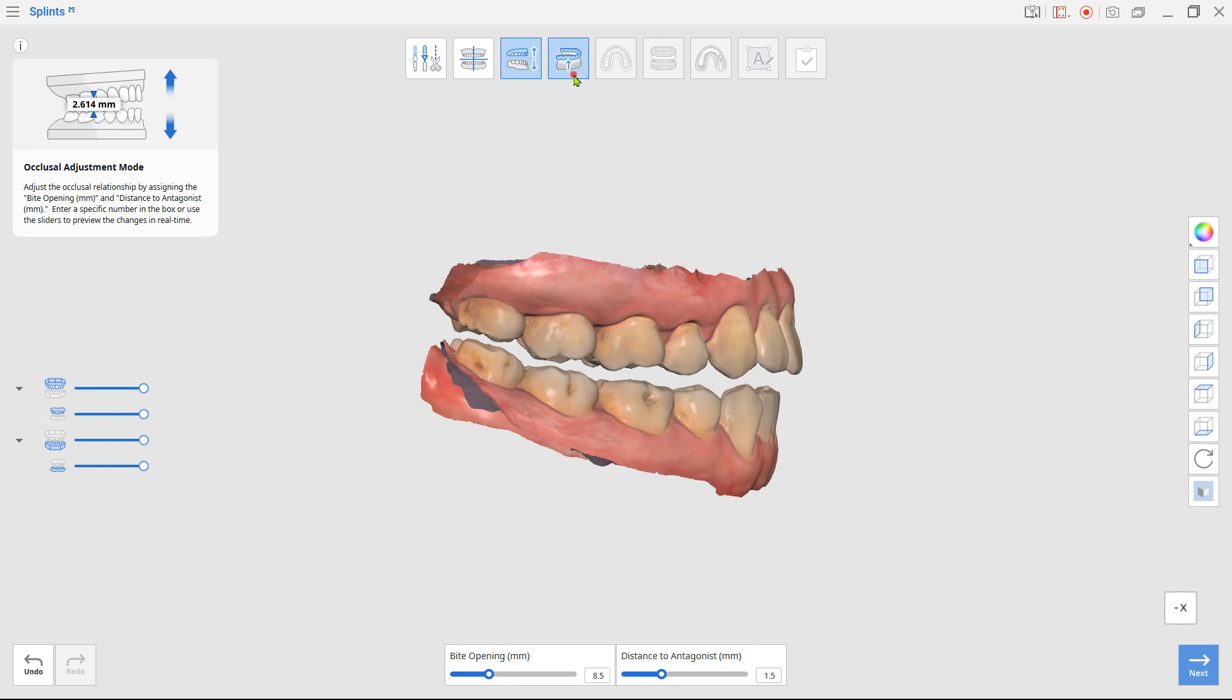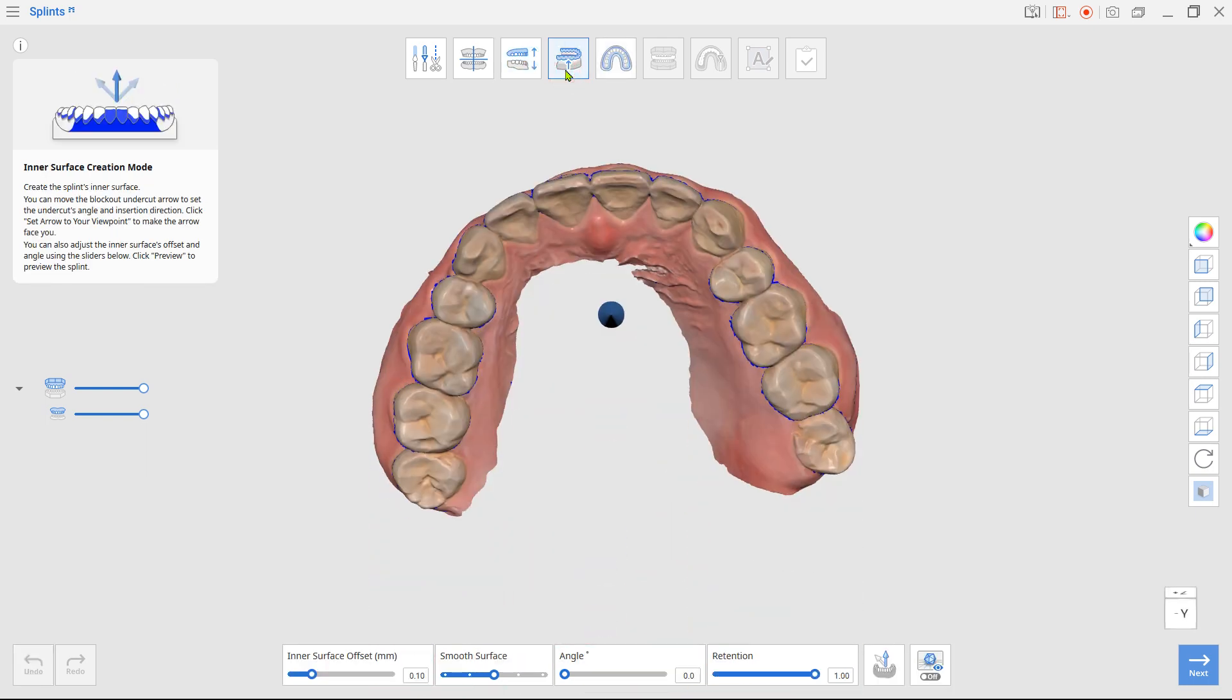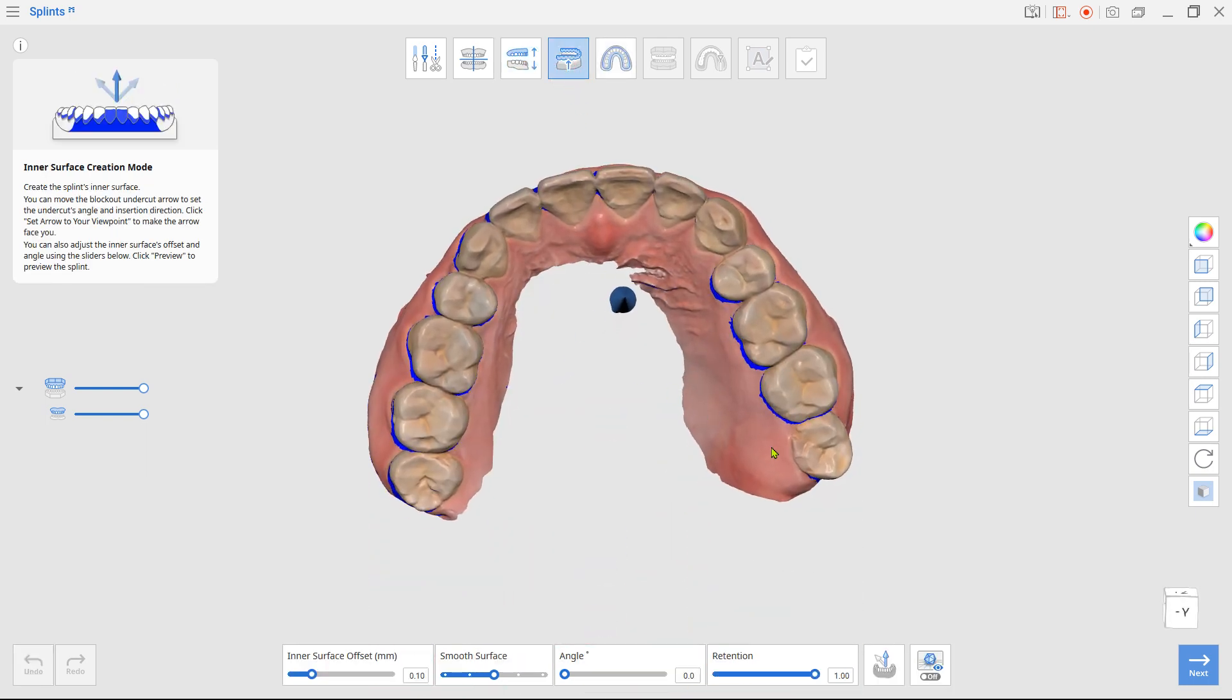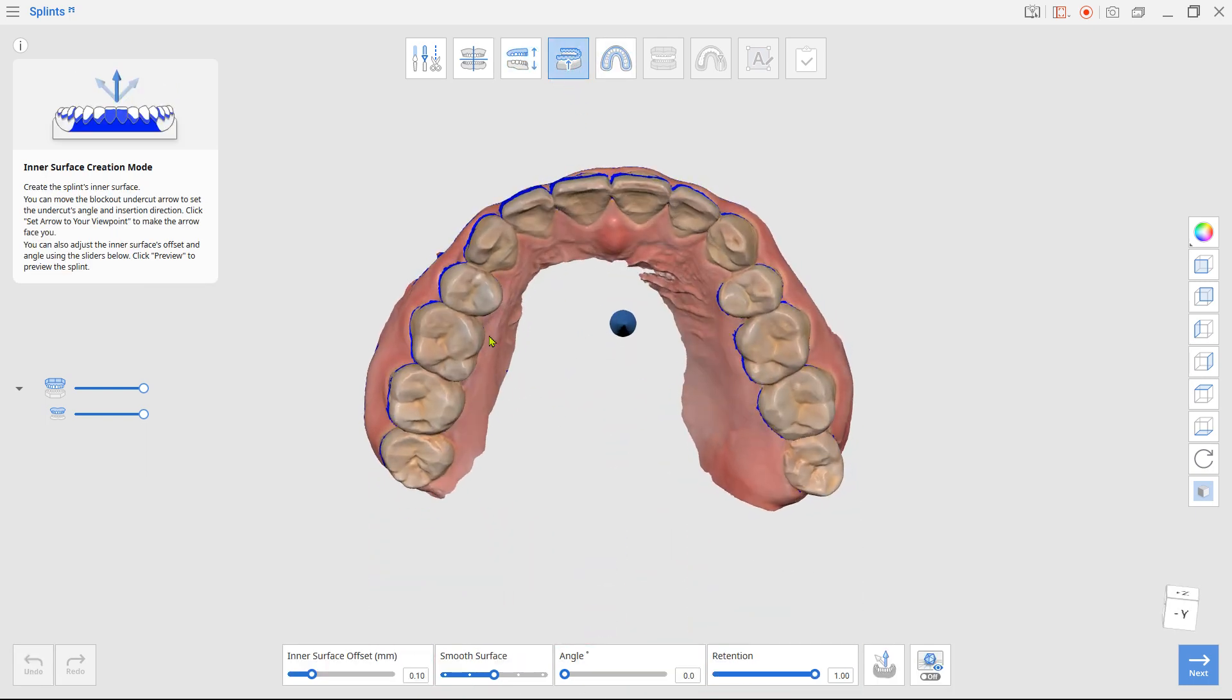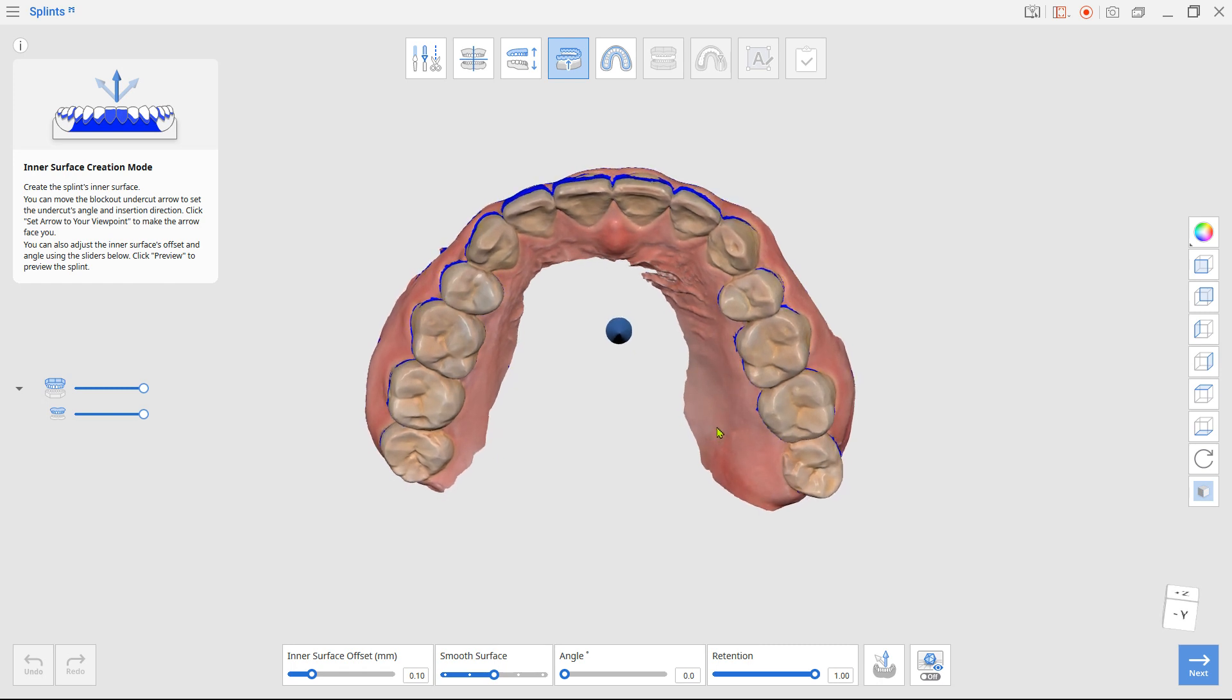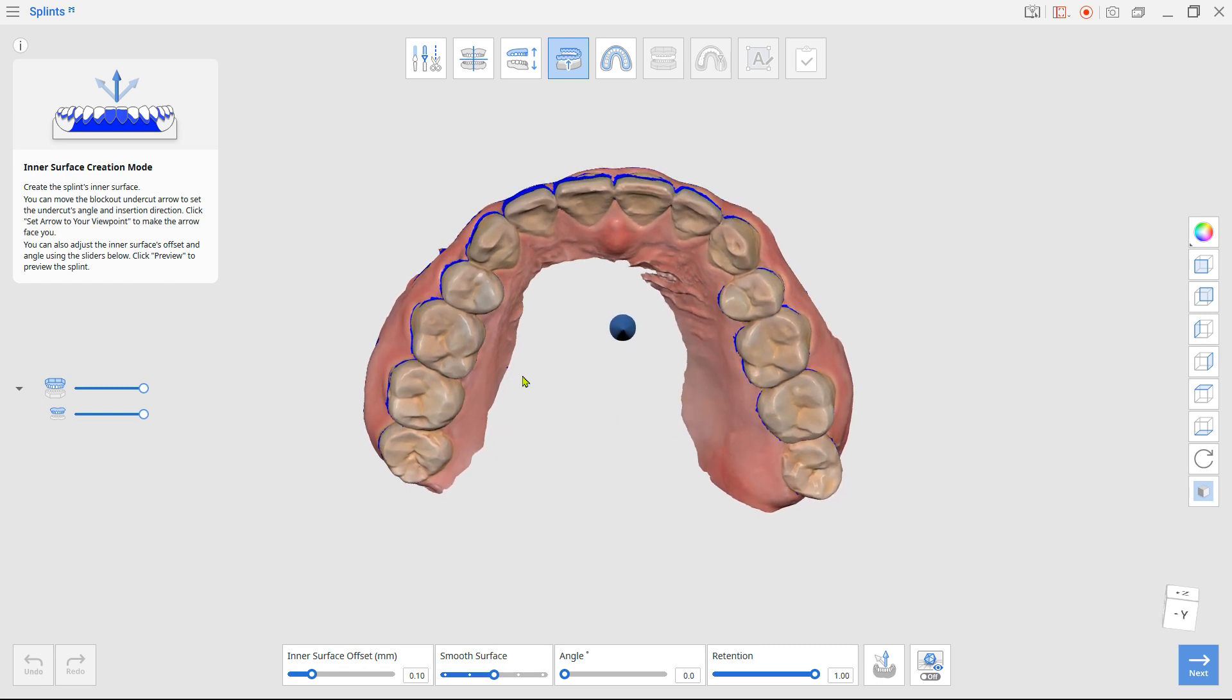Next, in the inner surface creation mode, rotate the arch data to set the insertion path and click set arrow to your viewpoint.